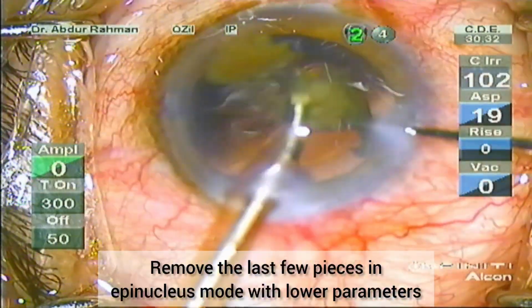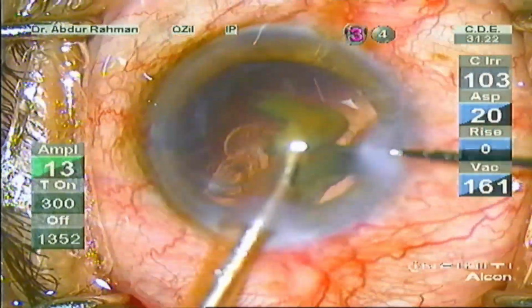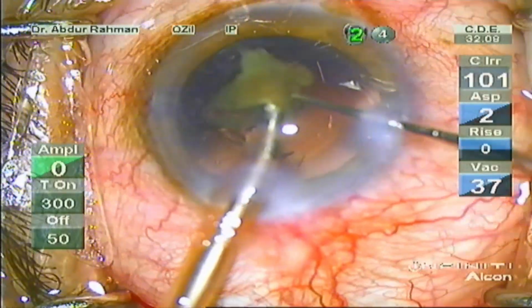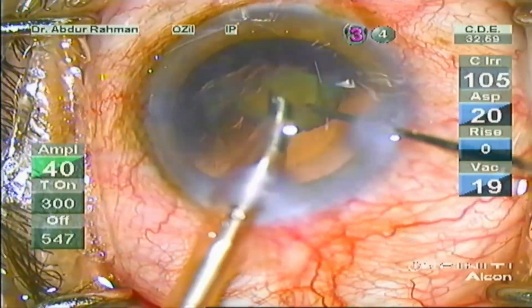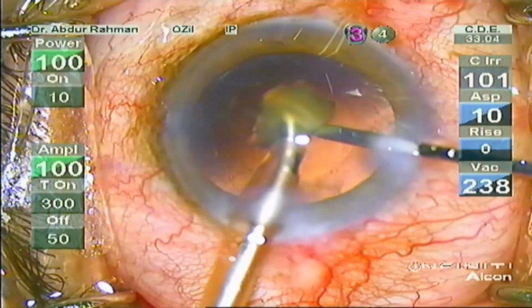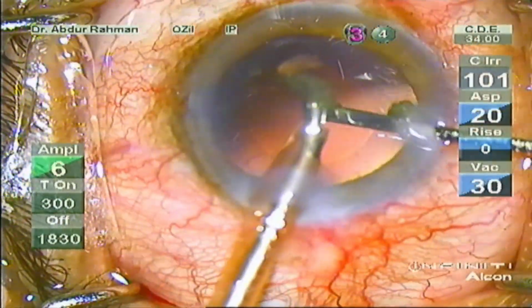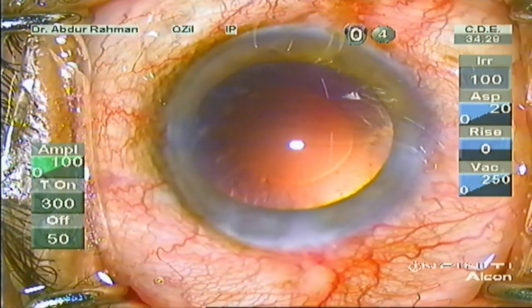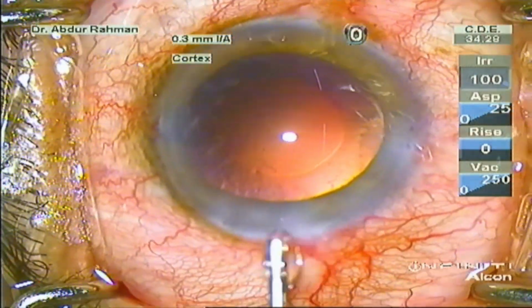Remaining two pieces came out of the PC bag, so I switched to epinucleus mode where all the parameters are lowered, so there will be less chance of surge and PC tear from occurring. Now with the spatula, use it as a shield and guard the posterior capsule. Now all the pieces have been emulsified.